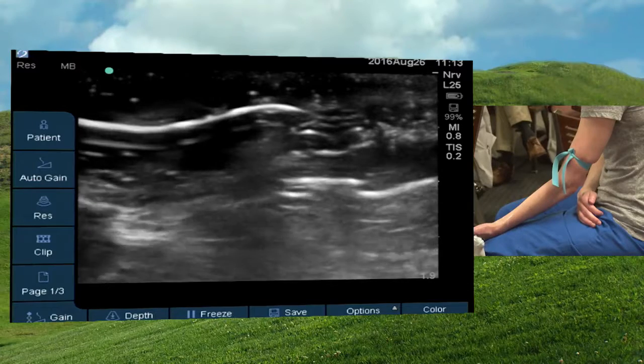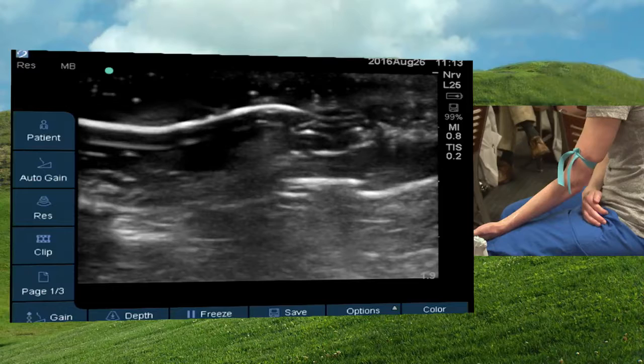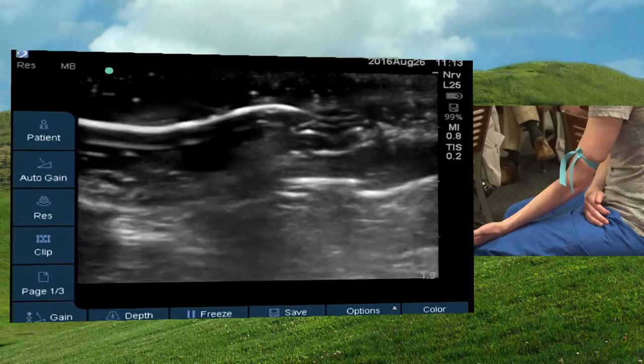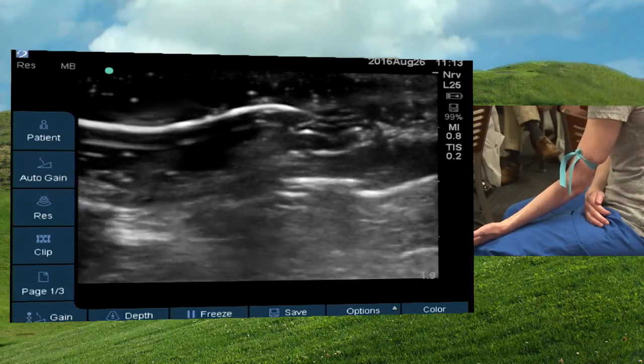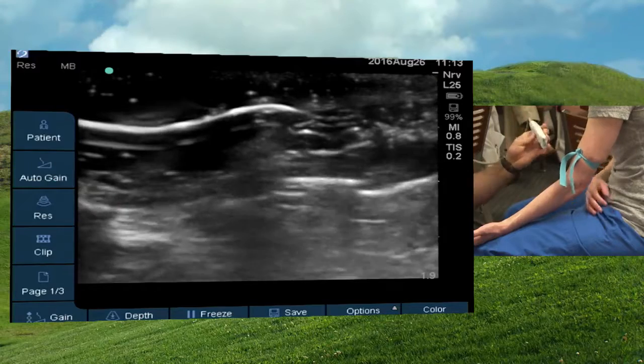And part of that is because patients can be difficult IV sticks for lots of reasons. Almost everybody has veins that are able to be accessed. You just can't always see them, okay? You can still stick her multiple times as though she were a hard stick. I could stick her multiple times. We do run needles down here in lecture sometimes, but today is not that day.